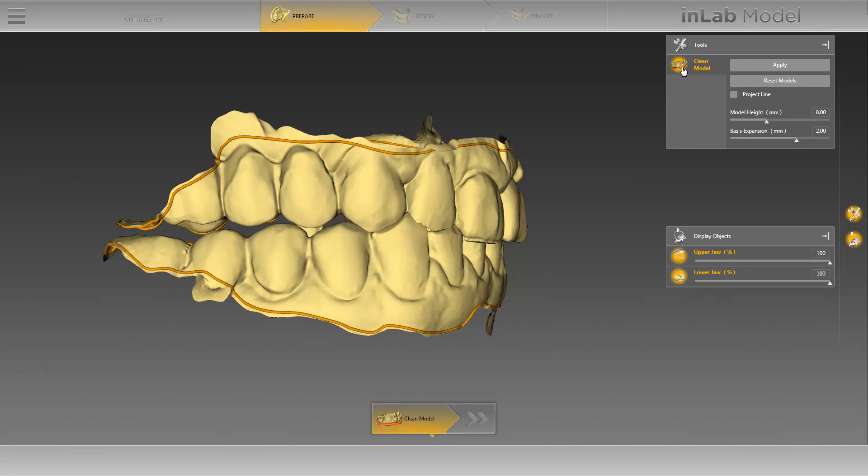When cleaning the model, make sure that you leave a sufficient distance to the cut line, particularly in the area around the implants, as you can create a gingival mask in the next step. With this tool, various functions are available to you.